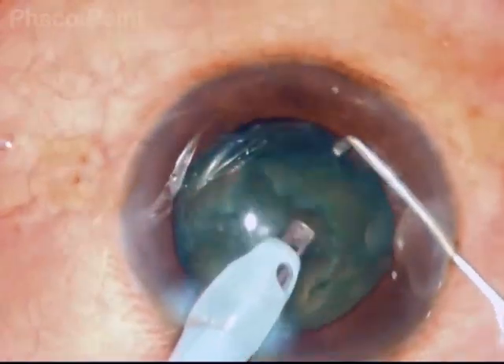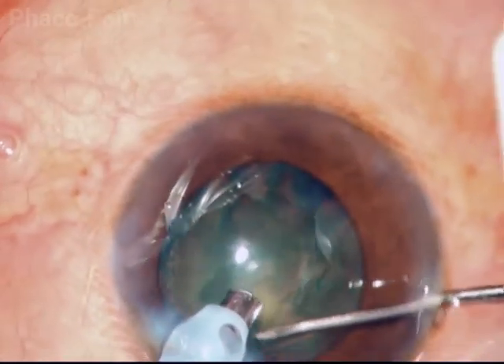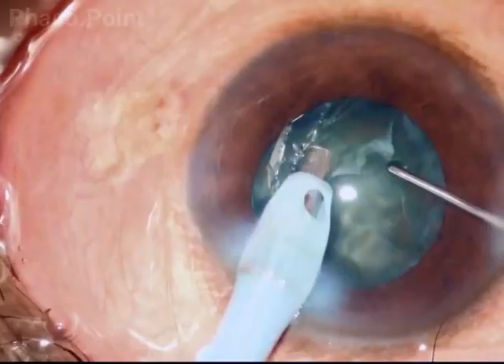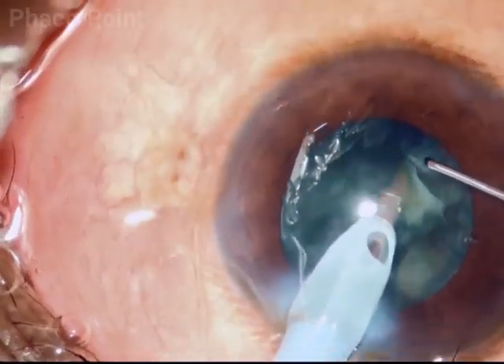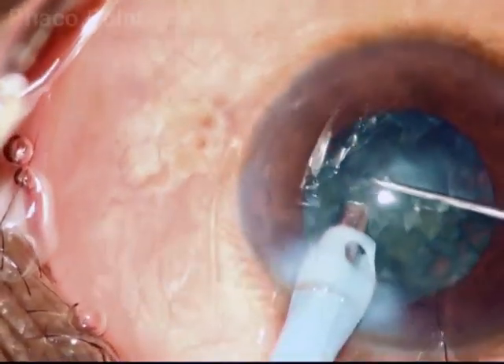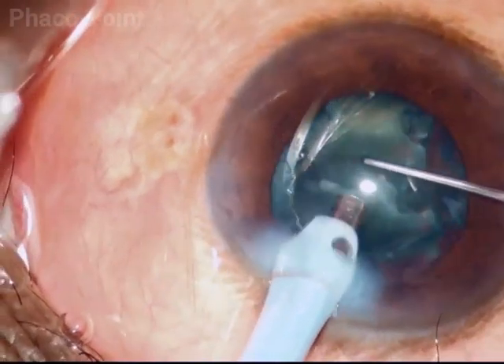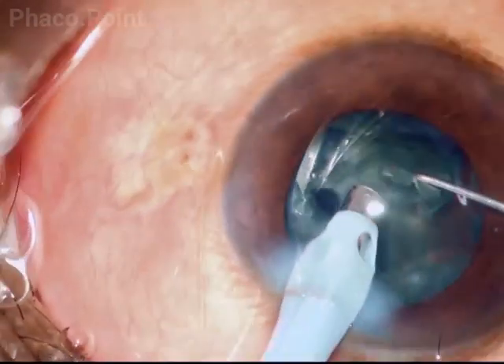The following cases depict exactly the same thing: the creation of the mechanical bowl, the difficulty and limitations in actually bringing this bowl out of the bag, and the challenges these pose to a successful phaco emulsification in these rather soft cataracts.